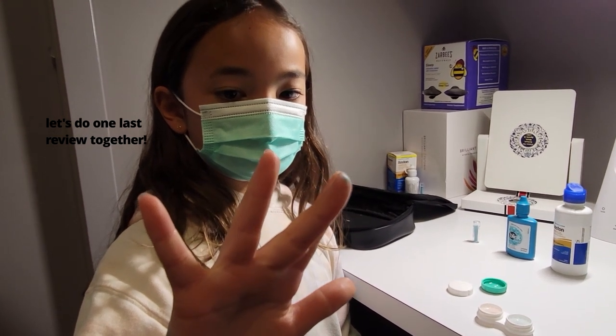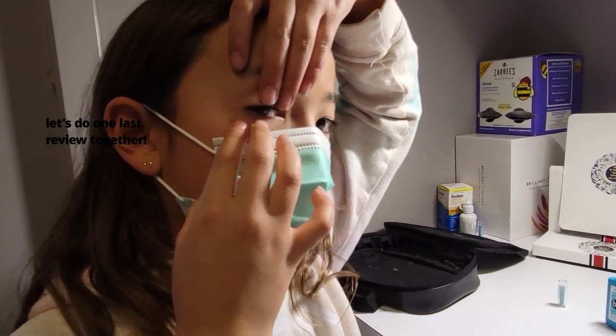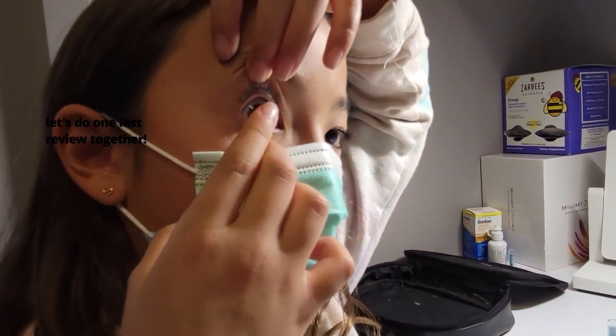Your middle finger and about two at the bottom and then one at the top so that you can put it in like this.